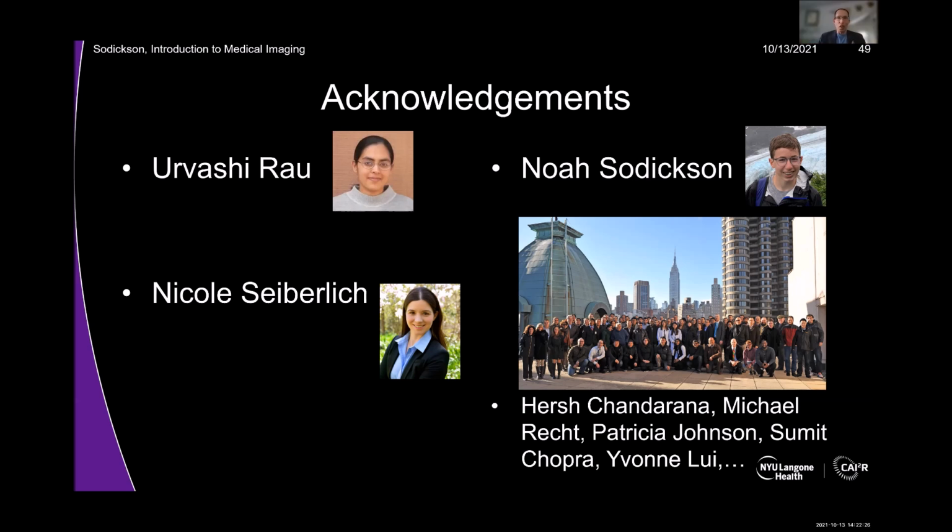Absolutely. I think the theme of this session is going to be, we share a lot of the same issues. So pretty much every medical imaging modality has a whole host of calibrations that are done under the hood that the experts may know about, but the users generally won't. So, when you're actually running an MR scan, if you're sitting inside the scanner and listening to the sounds, often you'll hear this sort of strange kind of tentative clicking and so on that goes on at the beginning. That's frequently a bunch of different calibrations that are being performed. And then there are all kinds of calibrations for the field homogeneity and the gradient linearity and any number of other things. So I showed some of those different terms in the generalized inverse problem. But yeah, we do any number of calibrations using various kinds of detectors to try to get these experimental effects separated out from our images.